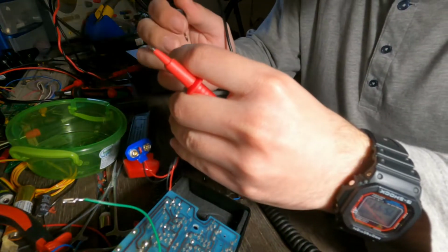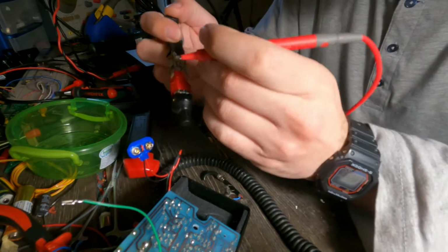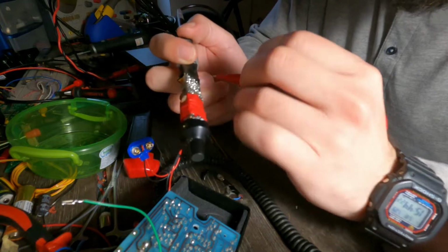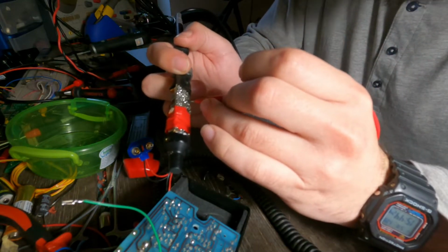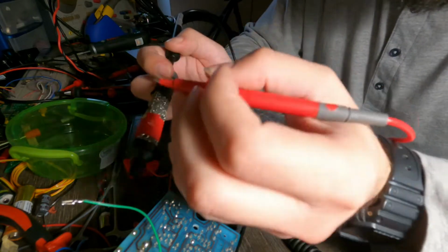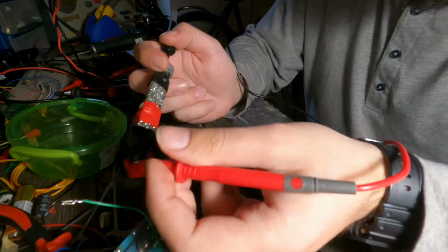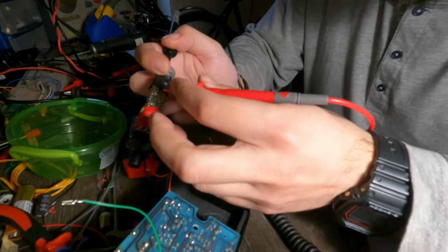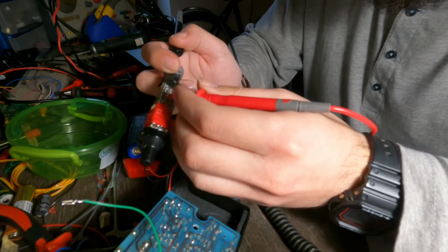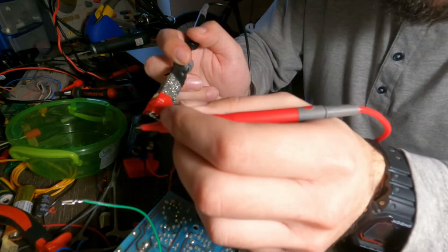So I have the ground in this pin, which is in the connector, and will be one of the traces that go along the whole PCB. This, in this case, is this one, and I assume that the power line will be another trace that goes throughout the board to deliver power throughout the board. It's not this, but this it seems goes throughout the entire PCB.